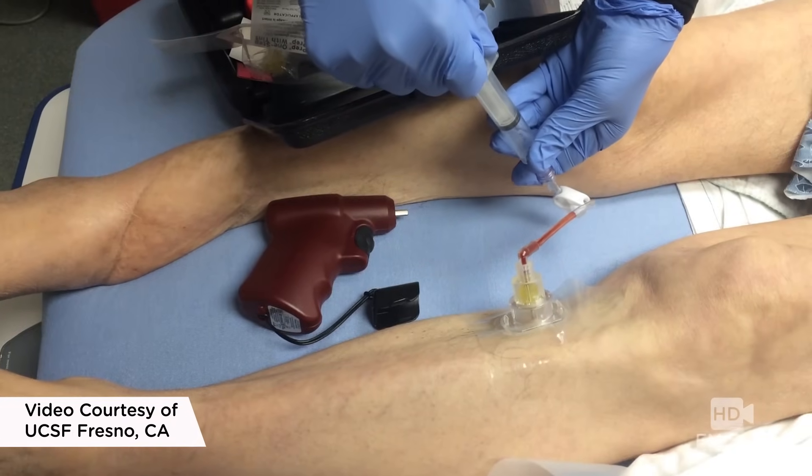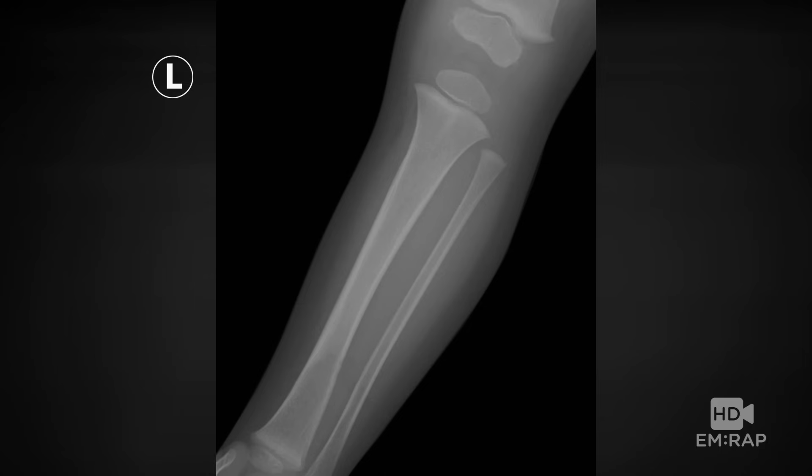Remember, you can give any medication through an IO line. For infants and kids less than six years old, the proximal tibia is actually the preferred site.